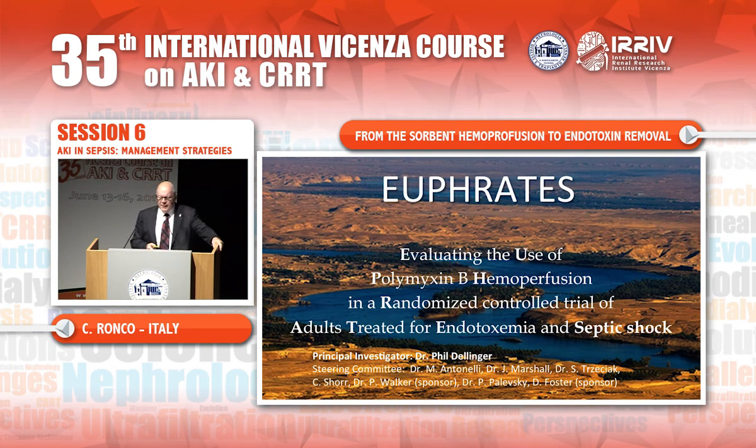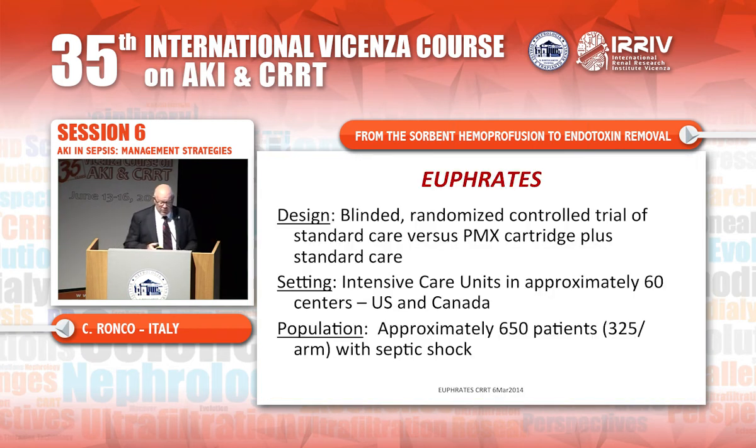What about EUPHRATES? Well, this is a unique study because it was prospective, blinded, randomized, and controlled, standard of care versus PMX, in several intensive care units in the United States and Canada.